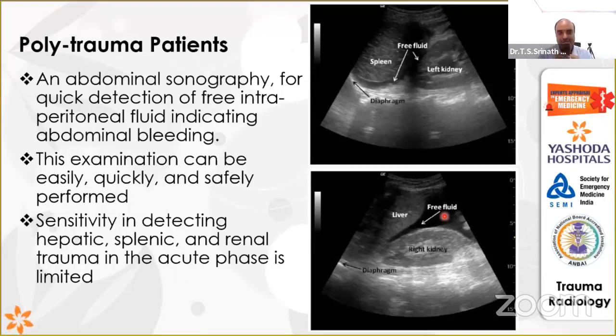Why is this patient's GCS dropping? So what is my next step of action? I have to take a CT scan of the brain. I have to note whether this patient has an EDH or not. Immediately you have to call for the neurosurgeon. And if required, you can keep your burr hole set ready in your emergency department itself, so that the burr hole can also be done in the emergency itself. This is how it is becoming more and more useful for you to diagnose these patients.